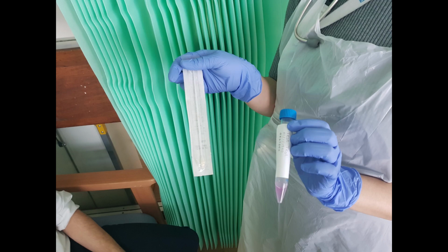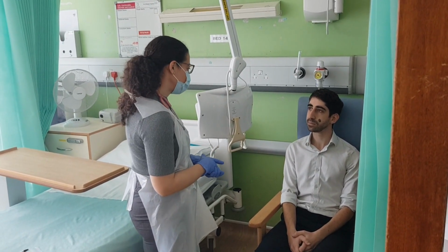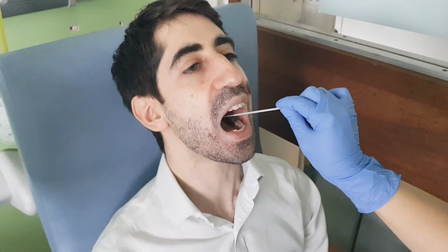Take the swab, the container, the specimen bag and the sample bag next to the patient. Explain the procedure to the patient and gain consent. Ask the patient to lean their head back and open their mouth wide. Swab each side of the back of the throat.